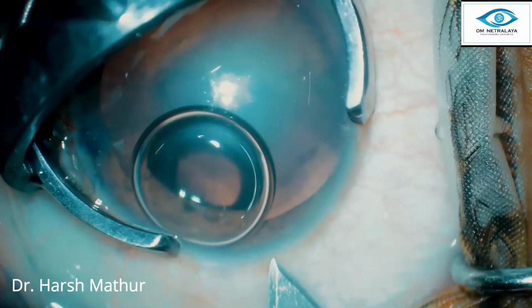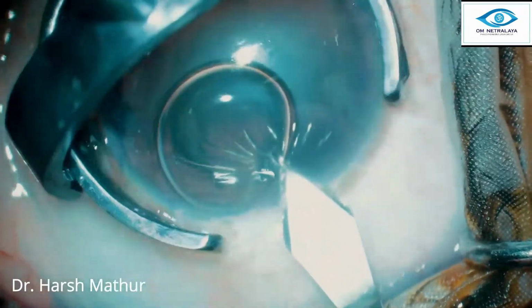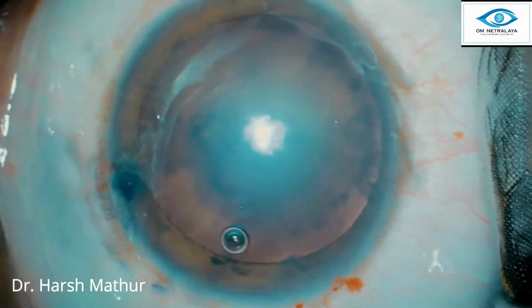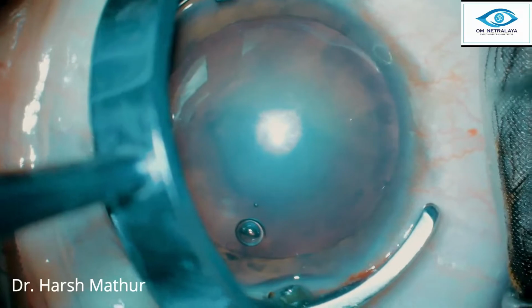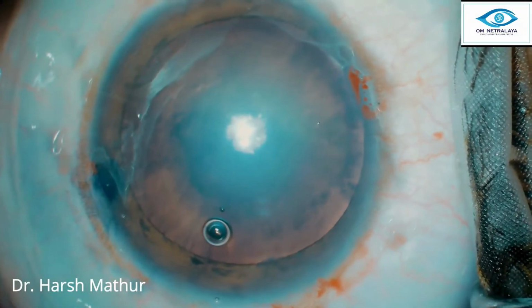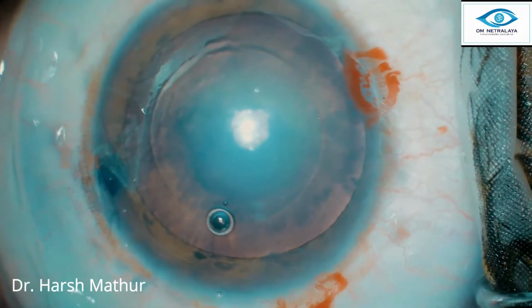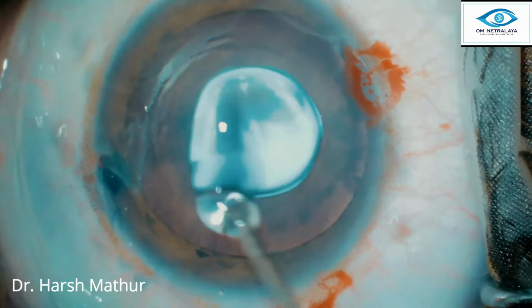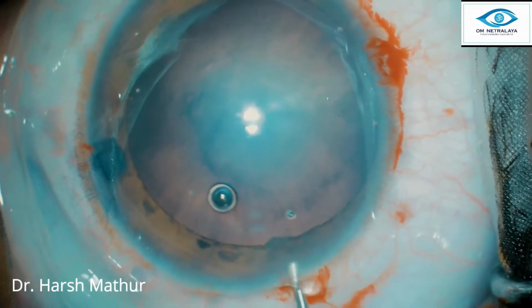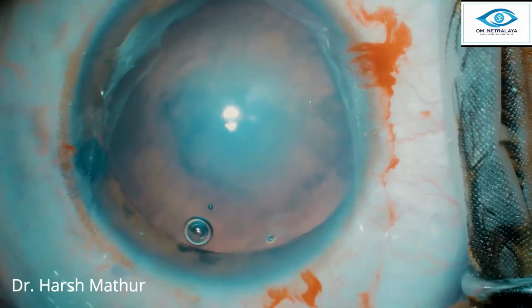But in these young patients, we prefer to make a relatively small rhexis, around 5.25 to 5.5. So bringing out the complete nucleus at times is a bit tough and poses a lot of stress on the zonules. So if hydrodelineation is done, then we can easily remove the central core endonucleus, and once that is managed, the rest of epinucleus and cortical matter can be easily managed.